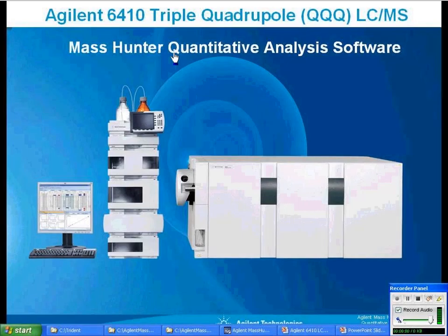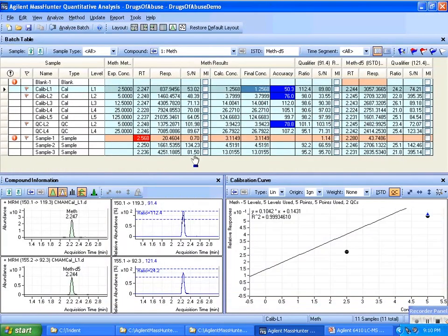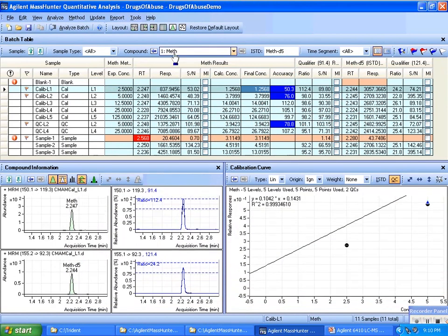Let me discuss a tool that's quite useful in managing your calibration curve. So let's go to the application. And here I see I've got the drugs of abuse. And for methamphetamine, I've got a problem at several levels here. The outliers warn me the accuracy at several calibration levels is poor, along with the QC.